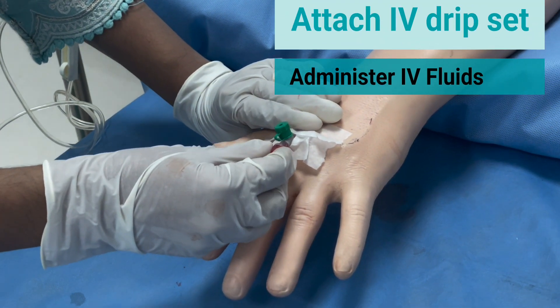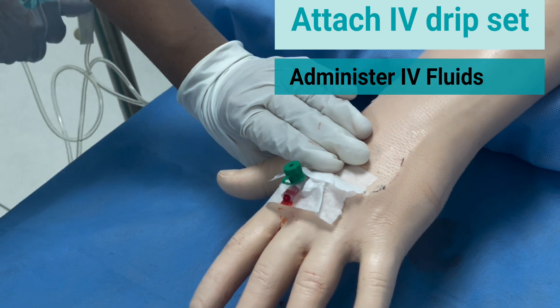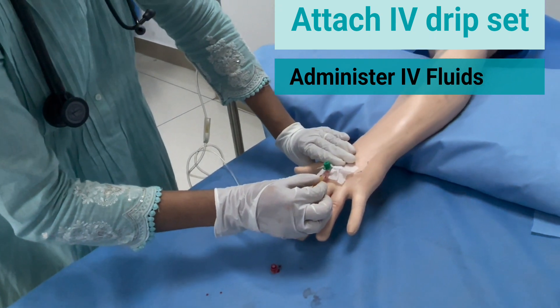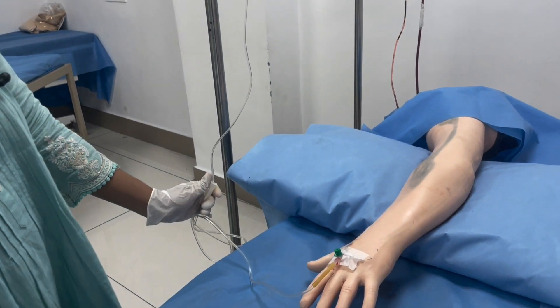Remove the luer cap again. Attach the IV drip set which is kept ready. Open the valve to ensure free flow.